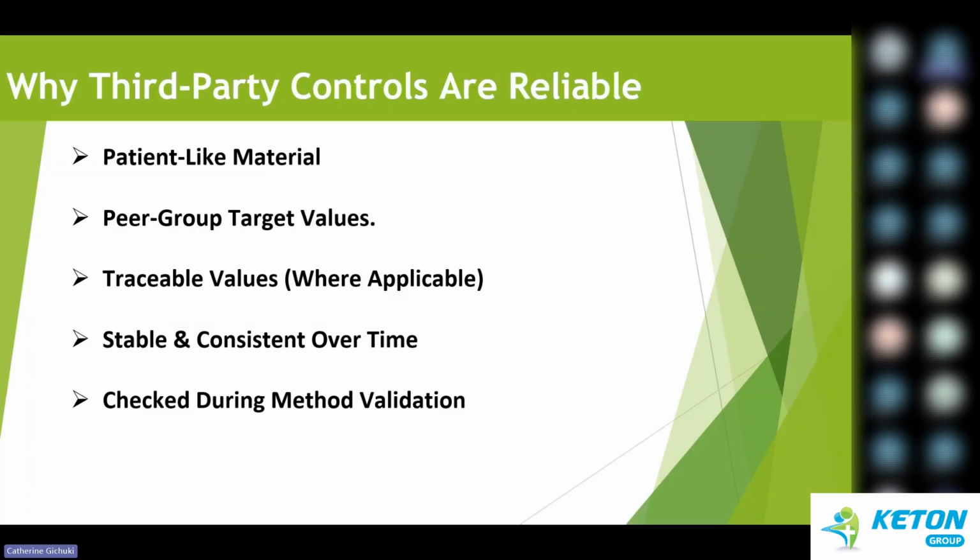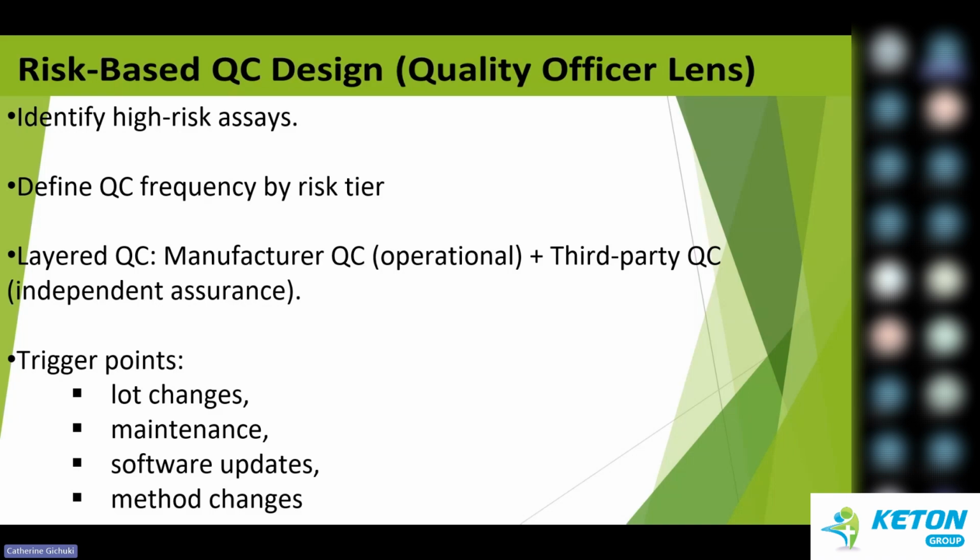are put in inserts. So if you're using, for example, Alinity or Cobas, you can see that there are values for Cobas, there are values for Alinity, there are values for Snipe, there are values for all those machines that we have been privy to use. So third-party QCs have been validated for those methods specifically.